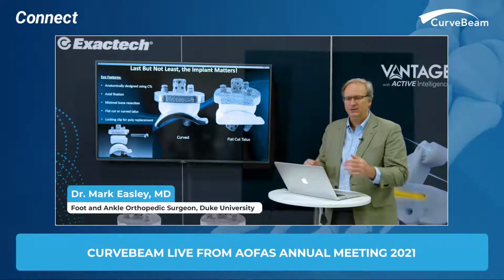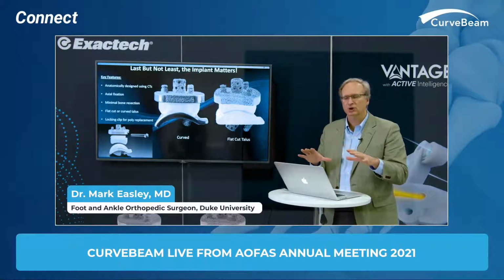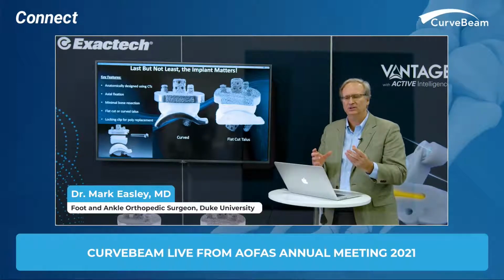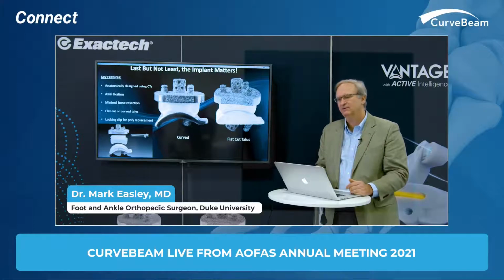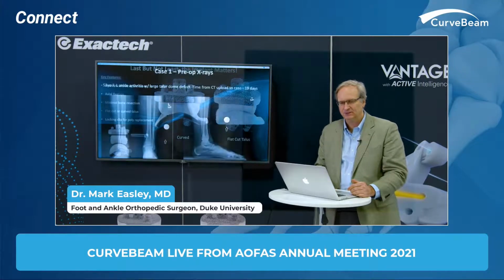And then the tibial component, you see, will take advantage of most of the surface area, and then also the pegs and the cage, they are all vertically oriented, so early weight bearing is possible because of the configuration of this, what then would promote, at least my feeling would be it would promote bone on growth, and hopefully some bone ingrowth, particularly with that cage. And so you can see here we've got the 2 different options available. There's a locking mechanism to lock that poly in exactly in the proper position.